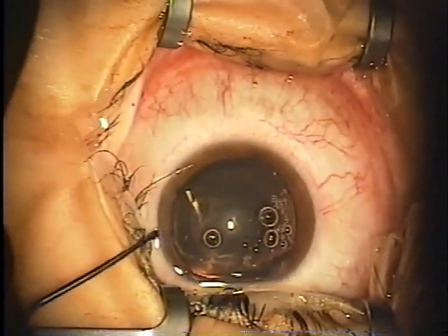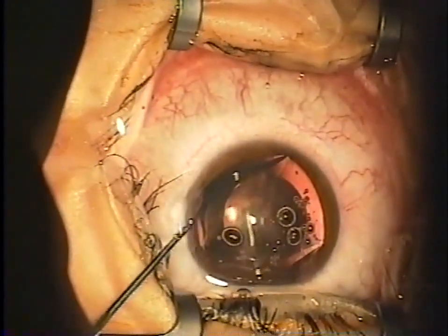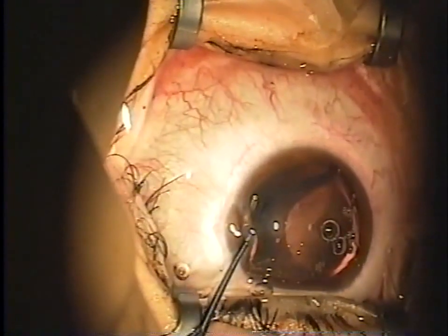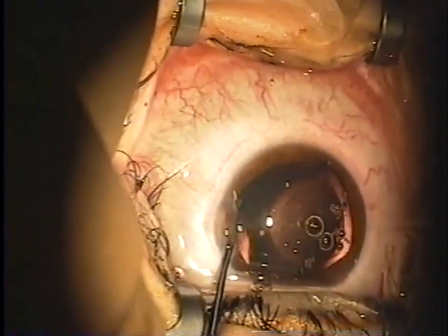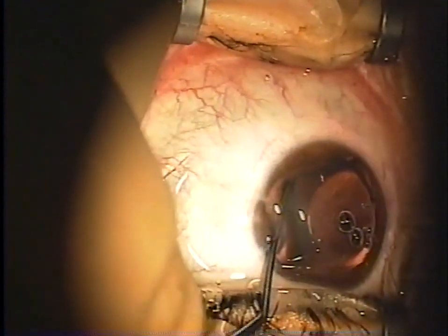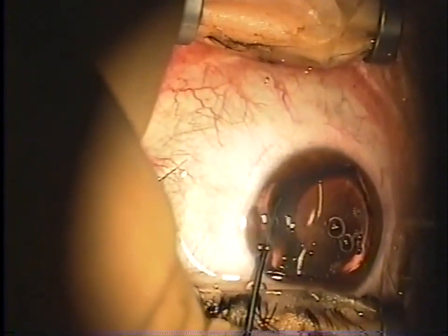Here you can see I've got the two haptics tucked, and then go through the main incision to tuck the two haptics on the other side. You don't want to ever cross over the center of the lens, as you might put pressure down on the optic and again cause local cataract formation.